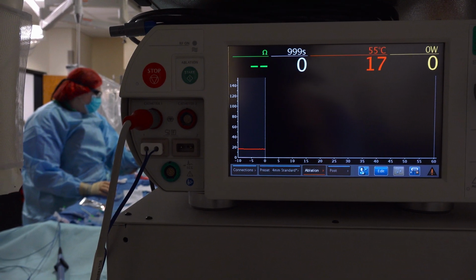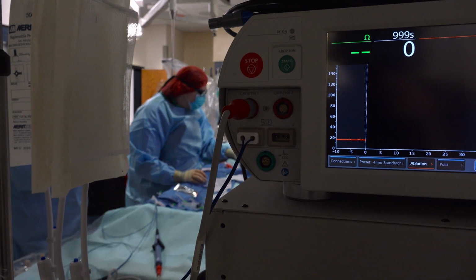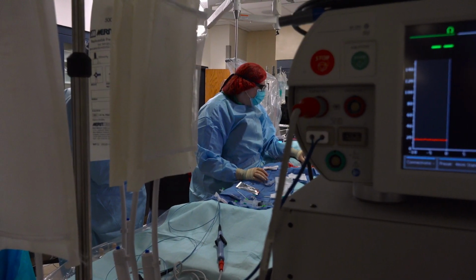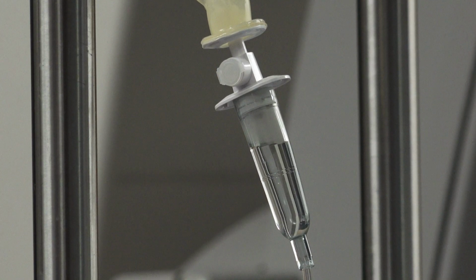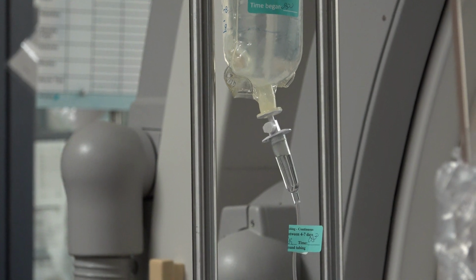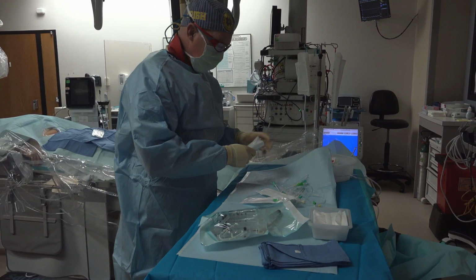The pacemaker implantation procedure takes between 1 to 2 hours and is performed in the electrophysiology laboratory of the hospital, where you will be placed on an X-ray table. You may be given medications intravenously to sedate you or make you sleepy. These medications help reduce your anxiety and relieve your discomfort.